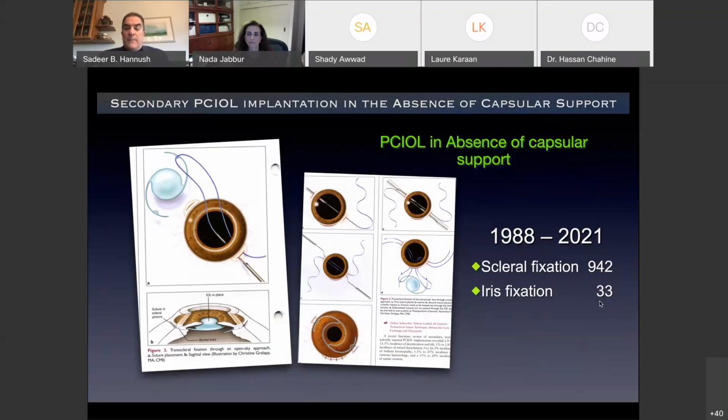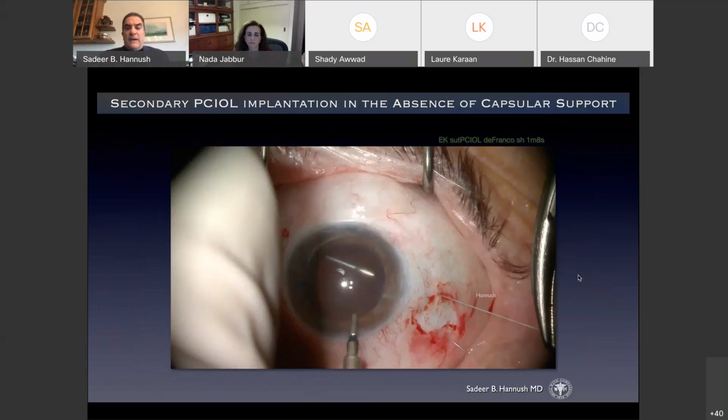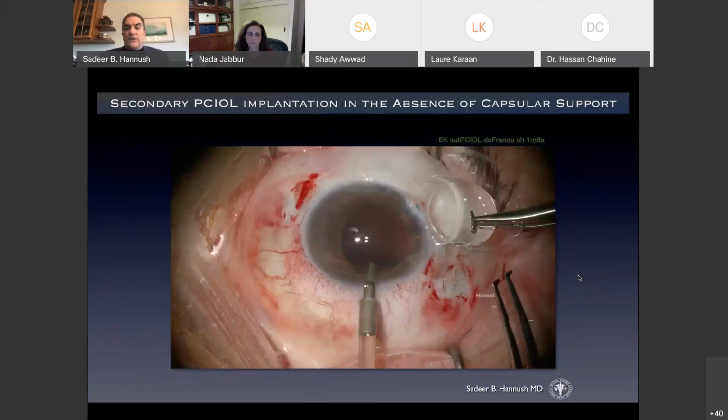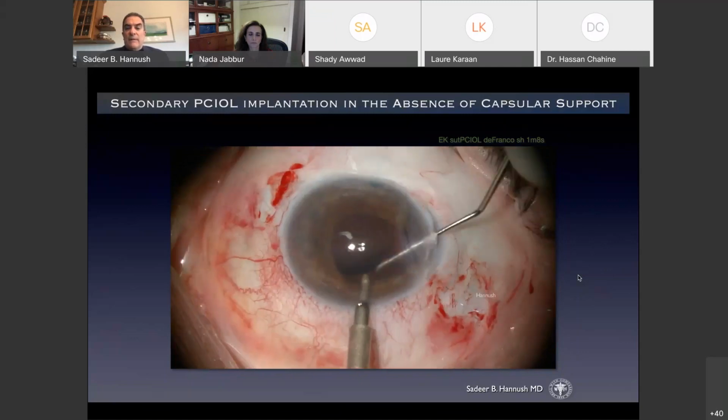This has been described many times, including the classical article by Walter Stark and Dr. Condon from Pittsburgh many years ago. I obviously favor a scleral fixation. So what I'm going to do with the videos is to try to give you one pearl on each video, not to basically teach the technique, because this is all available to you online. This is just an aphakic patient, and this is basically showing the use of transscleral suturing with 10-0 polypropylene suture to suture a CZ70BD lens, okay?